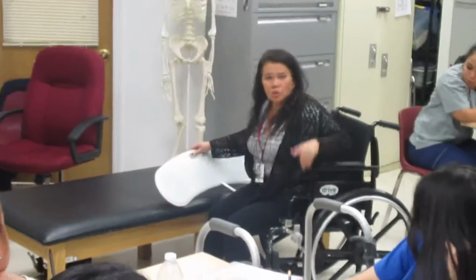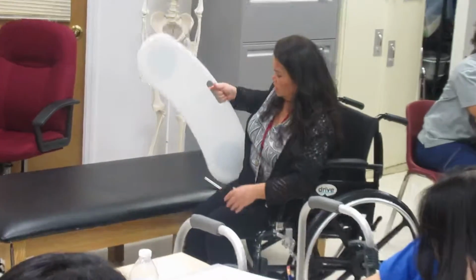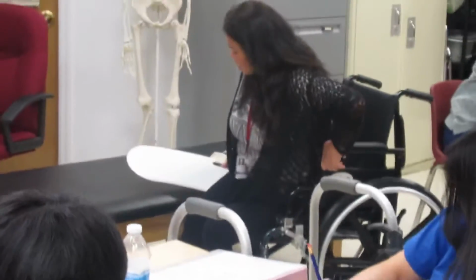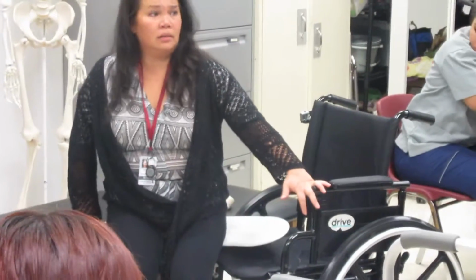You get them to lean towards the opposite side. Put this end, now the curve, the inside curve, the board should never be like this, right? The long inside curve should be right where you're going to be putting that patient under, okay? Now you're going to tell them, I want you to use this arm to push off, use this other arm to lean towards your surface. You're not lifting them, all they're doing is sliding. And then they just keep sliding. Very little assistance really is required.